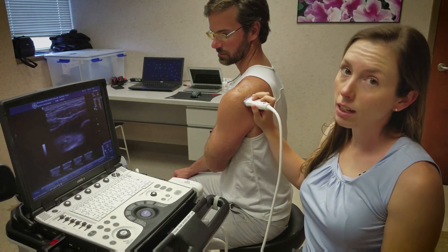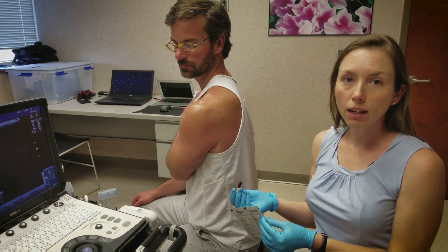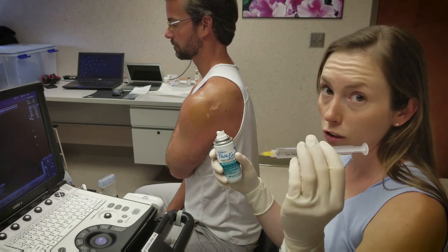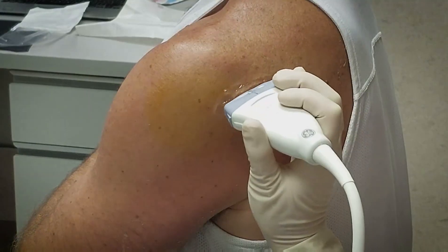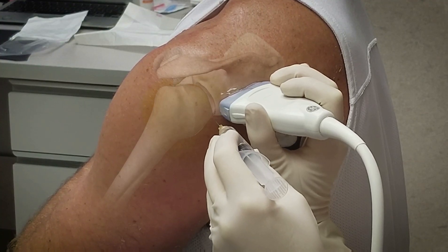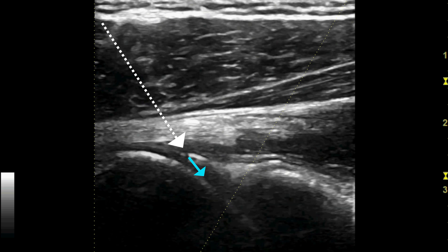After identifying your anatomical landmarks, you want to mark the insertion site for the needle at the lateral edge of the probe. Clean with betadine three times. Employing sterile technique, apply the cold spray and advance the needle superficially into the skin. The needle is introduced posterolaterally and advanced in the anteromedial direction in line with the ultrasound. Avoid injecting into the labrum or the tendon sheath — you want to inject directly into the joint space.